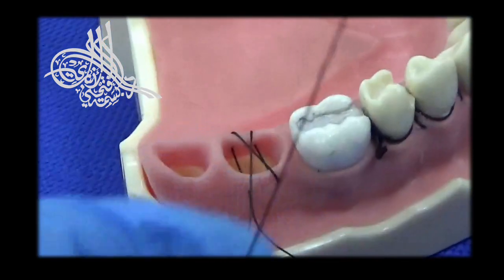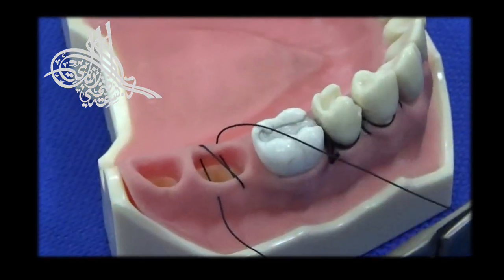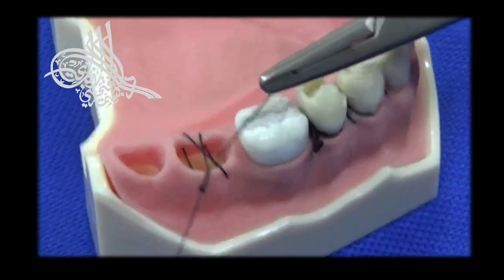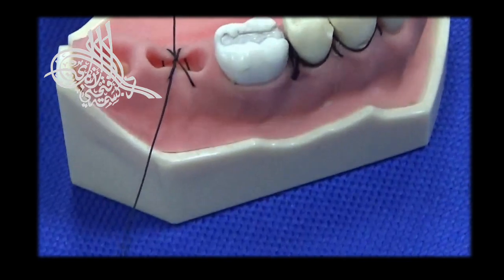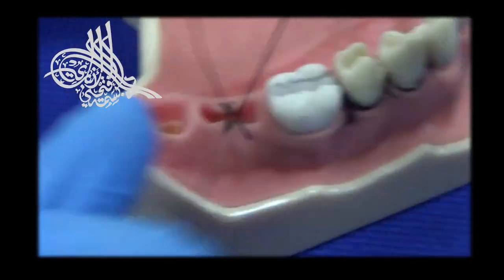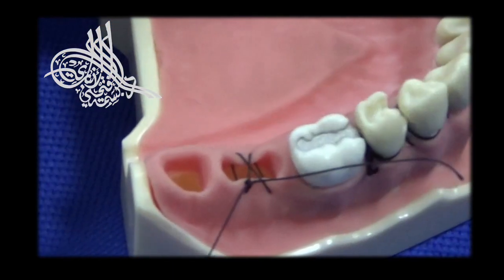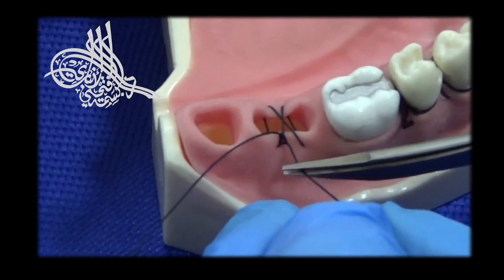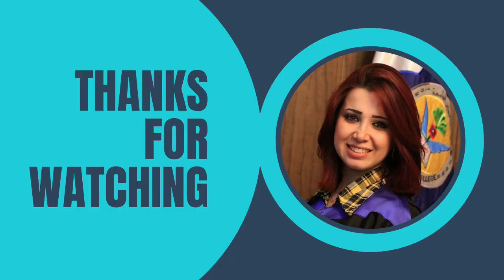Now, on tying the knot, the figure-8 will be apparent. Double throw. Now you can see the figure-8 shape. I'm going to show you how to make it easier.